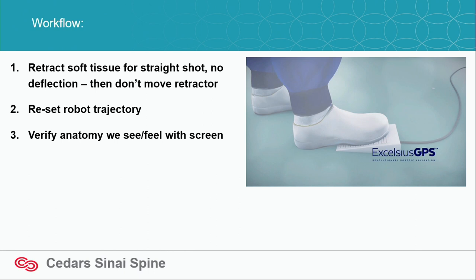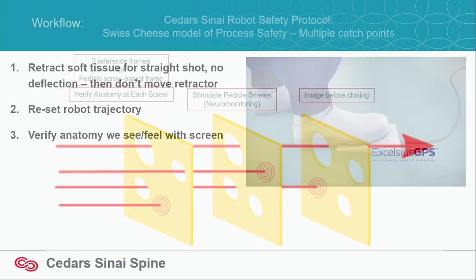As an example of why it won't slow you up, last week I did an anterior-posterior instrumentation fusion, spondylolisthesis, 3 hours skin-to-skin, front and back. Once you have this technique down, it is way faster. You do everything through these 2 centimeter incisions, just boom, boom, quick, done, out. But you have to take time to learn this. It's not that fast at first.